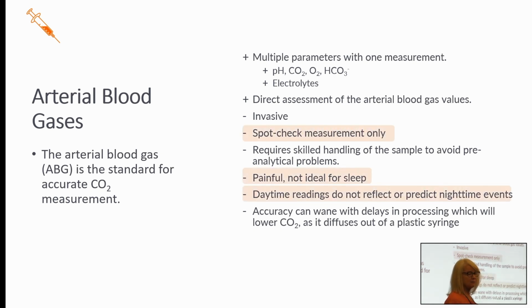The thing is, blood gases are painful, and it says that they can be painful. Well, I've had one done. They're painful. So they're not a great choice for the sleep labs because you're trying to prioritize a patient's sleep. They are also just a point-in-time measurement. So if you're doing a blood gas before the study and then maybe halfway during the study or after the study, there's a lot that can be going on in between those data points that we don't have visibility to.